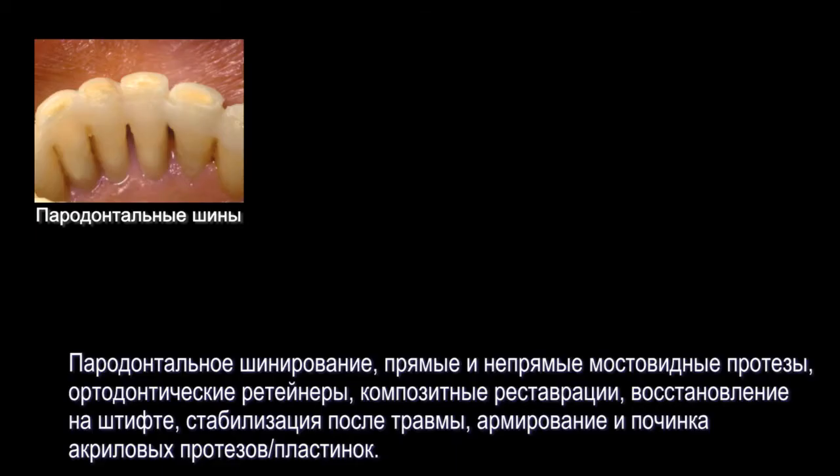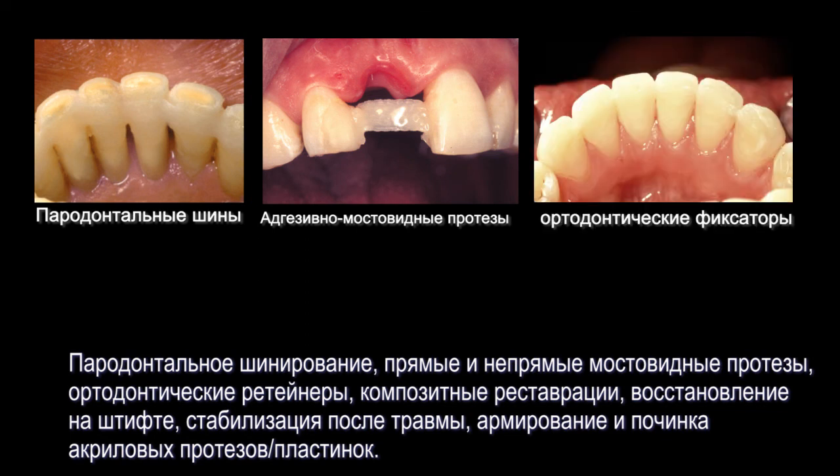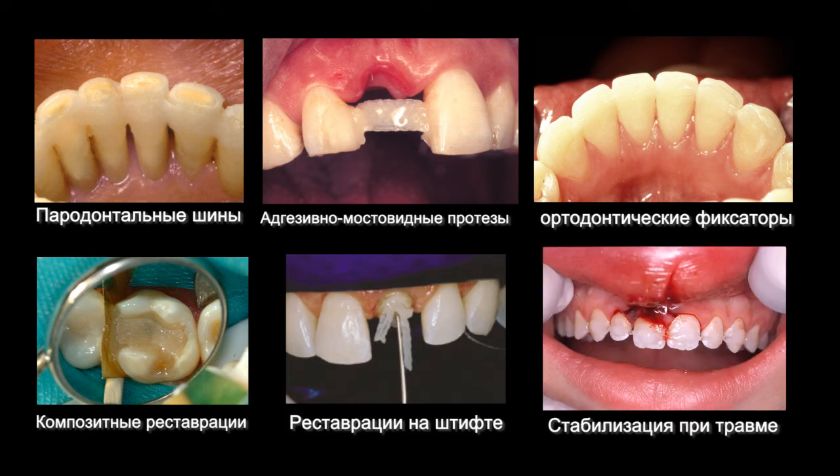Ribbon Dental Applications: Ribbon is used for periodontal splints, direct and indirect bridges, post-orthodontic fixed retainers, composite restorations, endodontic post and cores, trauma stabilization, and acrylic reinforcement and repairs.